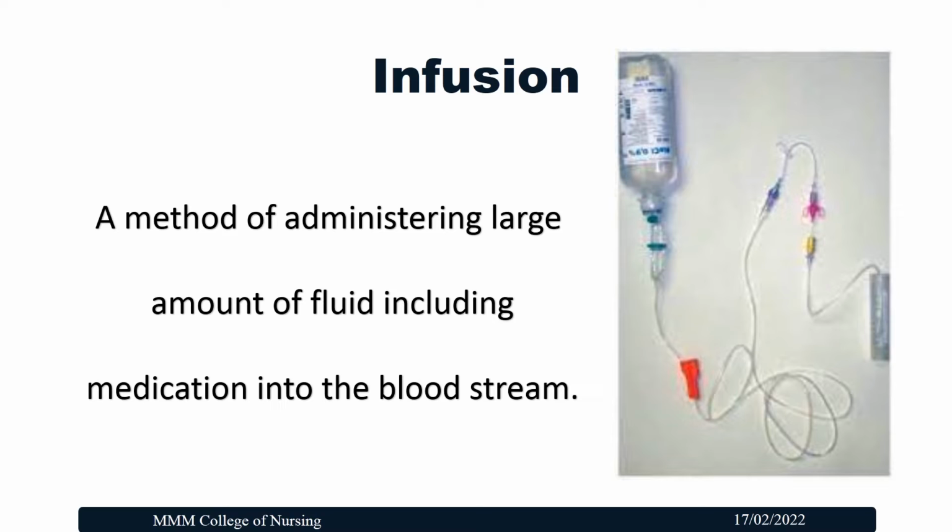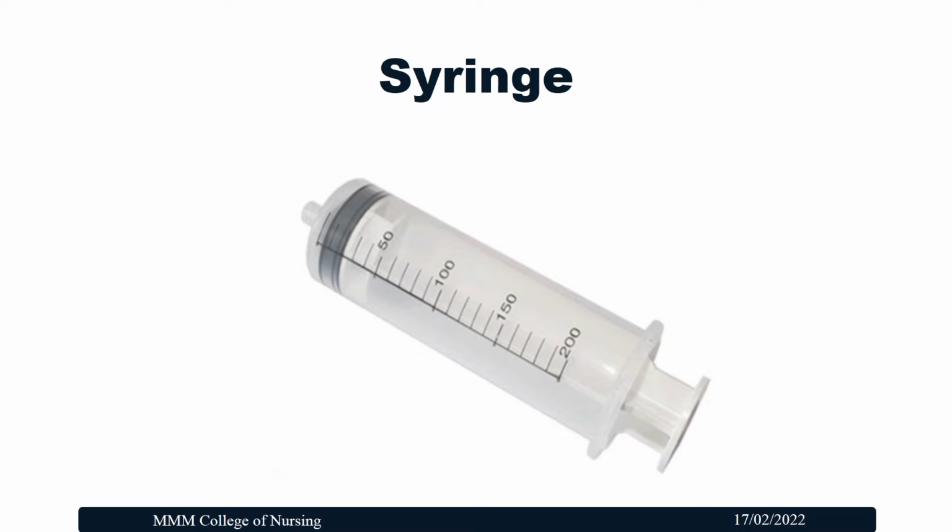Infusion is a method of administering large amount of fluid, including medication, into the bloodstream. A syringe is a simple reciprocating pump consisting of different parts which help to withdraw or load the medicine from the medication container and to administer or inject it into the patient's body.